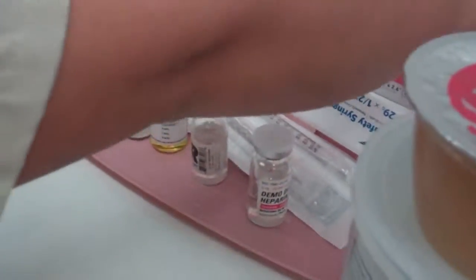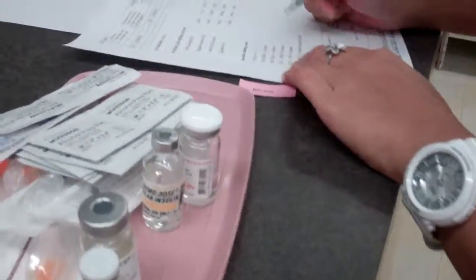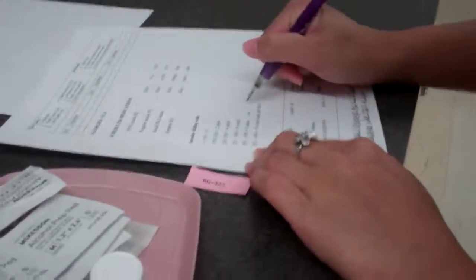Let me grab some alcohol wipes. So my next nurse knows why I'm giving 8 units, I'm going to mark that my blood glucose was 323. So that's why I'm giving 8 units.